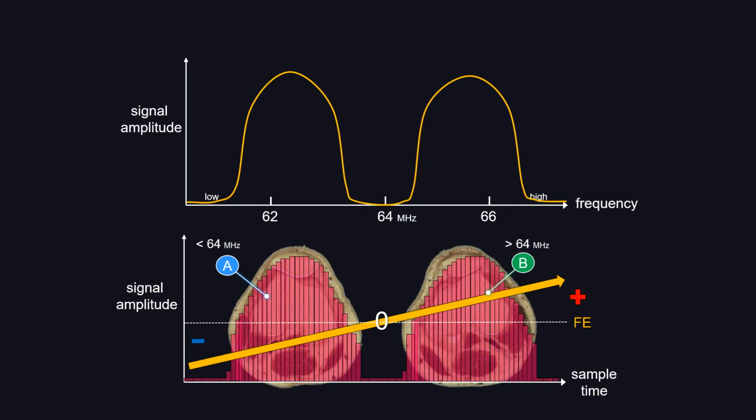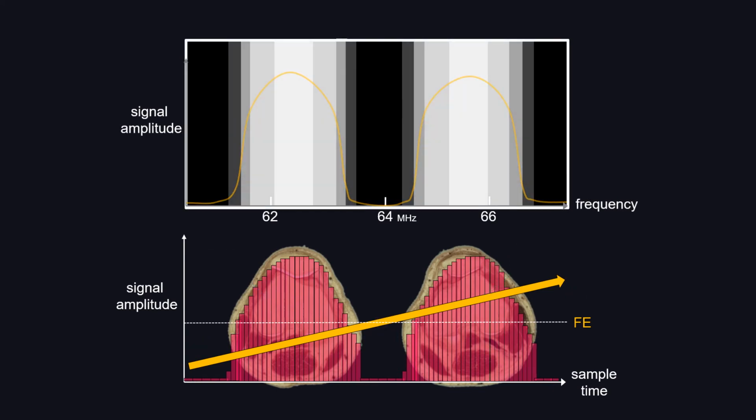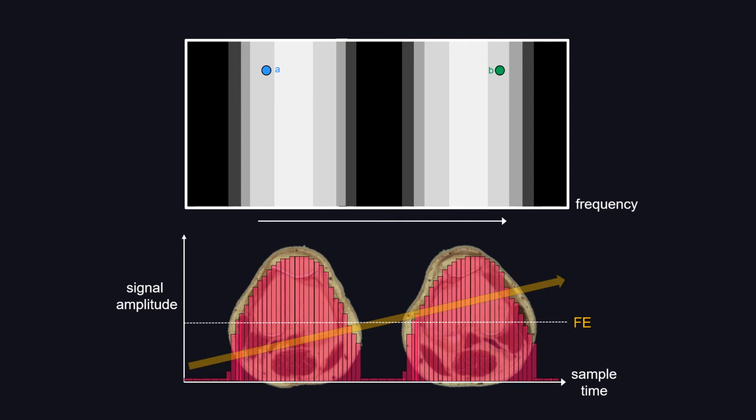that looks like this. If you assign the signal amplitude to the grayscale, the higher signal is going to be whiter. When there's no signal, it's going to be pitch black. That's starting to resemble the anatomical picture. So now you can tell the signal is coming from column A versus column B. But you do not yet have the ability to differentiate between different points within the same column, point A and point C. Now you have to separate them into different rows.